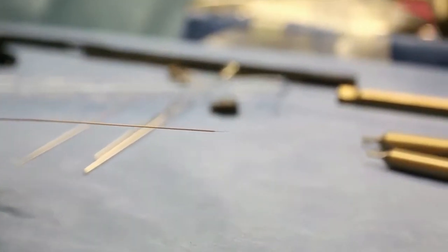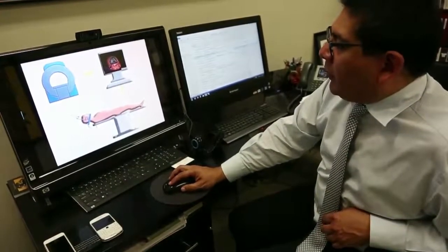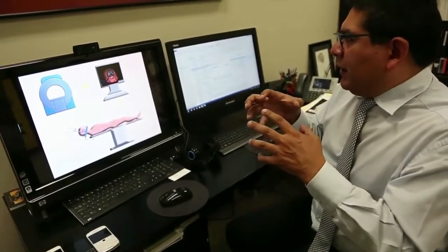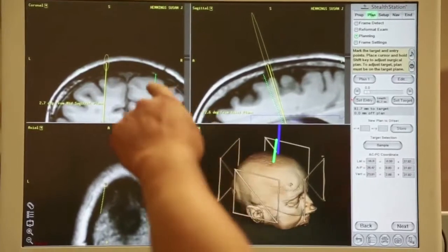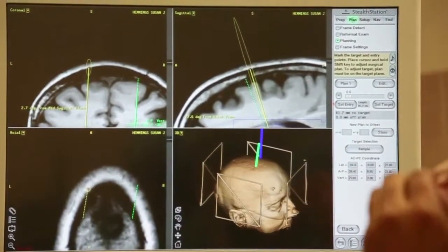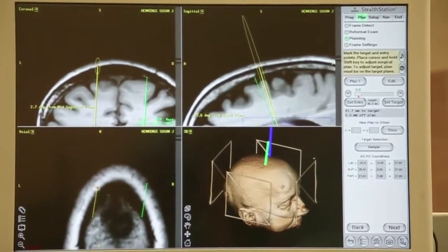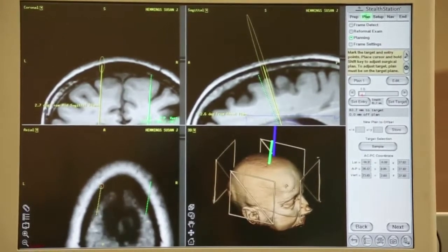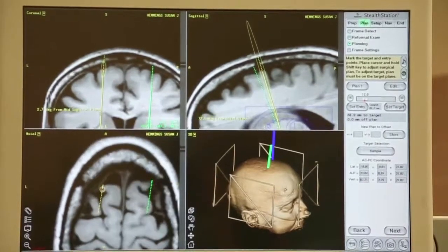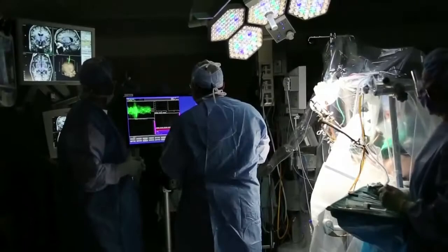produces the electrical stimulation. The data from the MRI is transmitted to a computer in the operating room, and we do the surgery in virtual reality in the computer. See this yellow? This is where I'm actually entering the skin. And then you can see I can follow my trajectory of how actually I'm going to go. So I have complete control now of exactly what's going to happen in the OR before even we touch the patient. You guys ready?